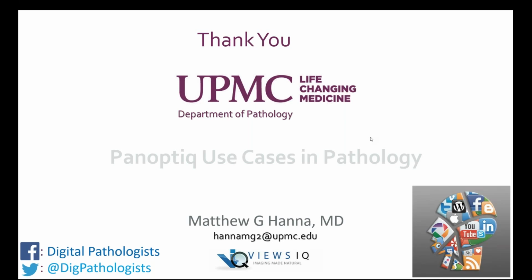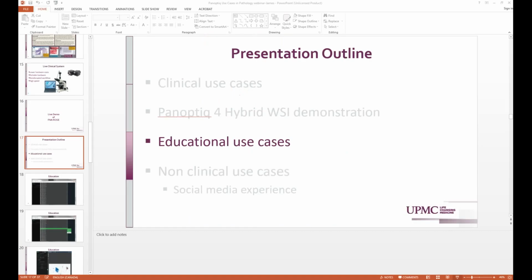Another question is, how are the images managed? Is there a PACS-like image management system in place? So our PACS-like image management system would essentially be the portal. I can go back and show you.